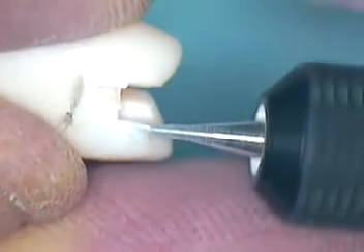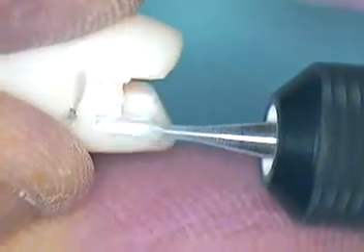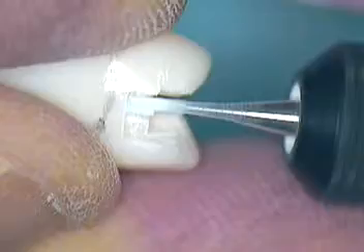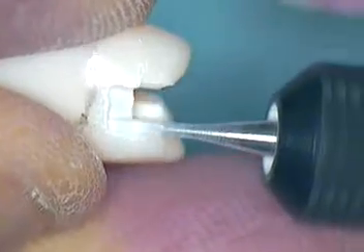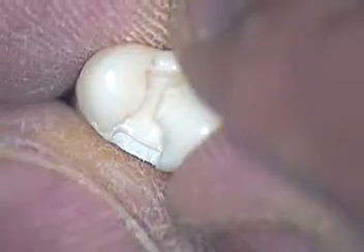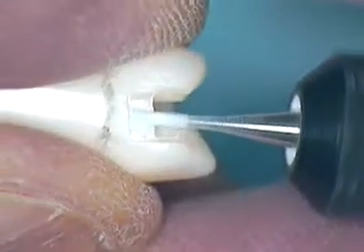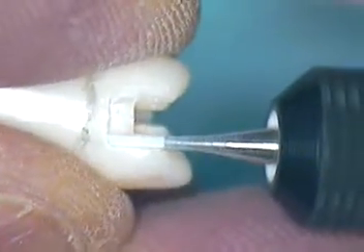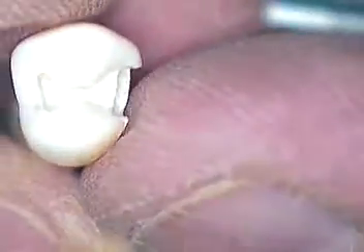Hopefully I'm maintaining the S. I'm also looking at this floor and this floor here, and I want to keep those two parallel with each other as well. So it's all this 3D stuff going on.